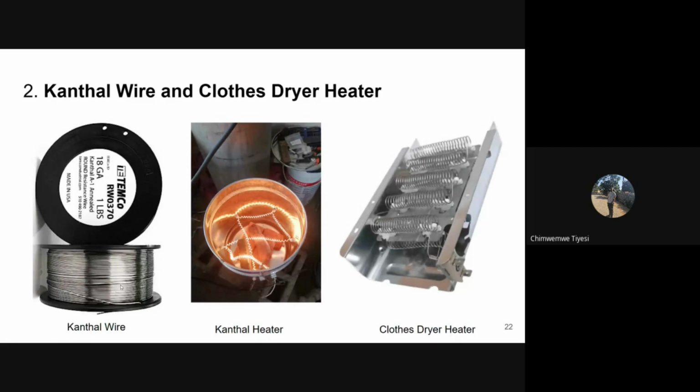When this happened, we tried to use heating elements from a clothes dryer. We also noticed that the coils on the elements changed shape after using them for several hours. Later on, we noticed that the wires shorted out. So we had to abandon the heater from a dryer.